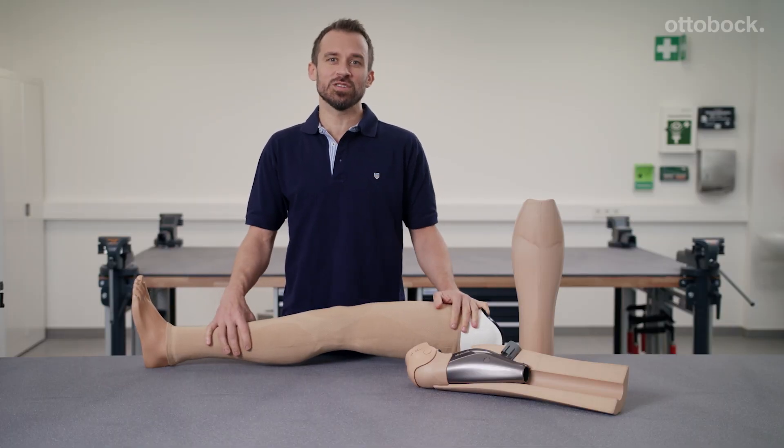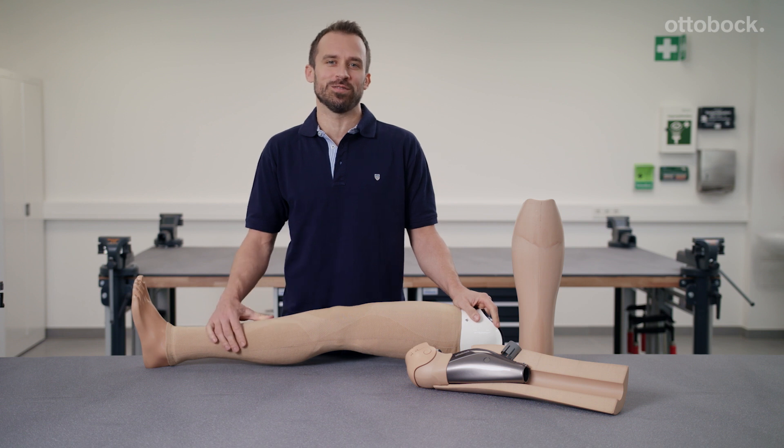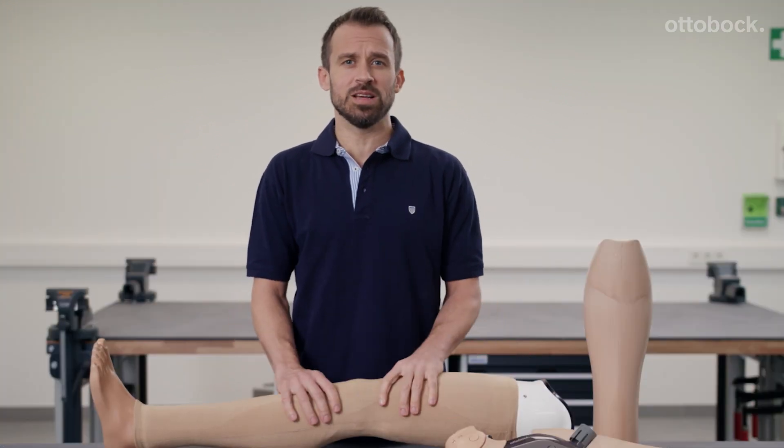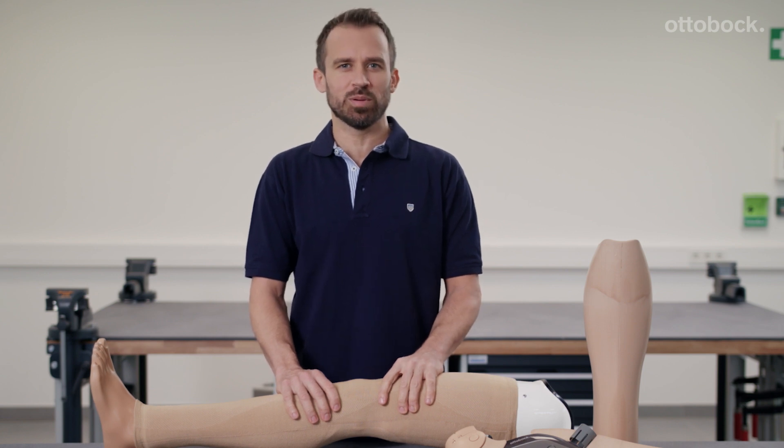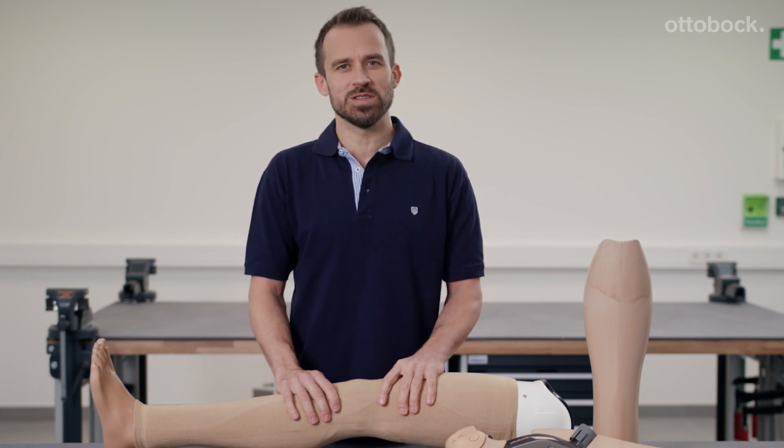Experience the advantages of a functional cosmesis for yourself. Please see the detailed alignment video for tips and tricks on how to align a C-Leg or Genome leg prosthesis with a functional cosmesis.